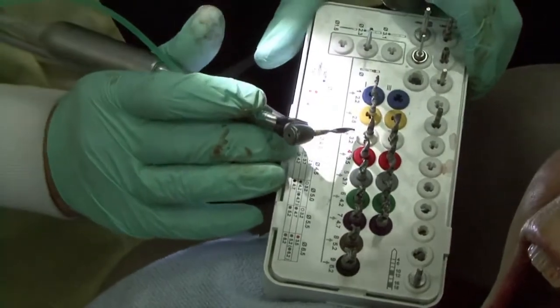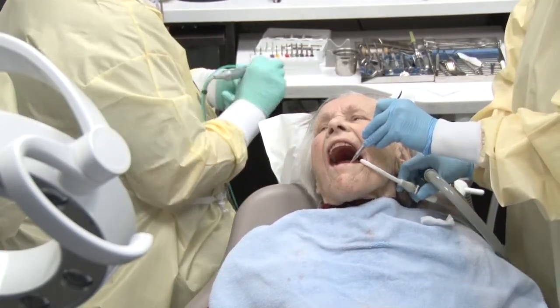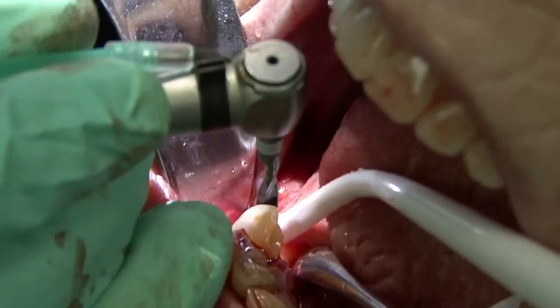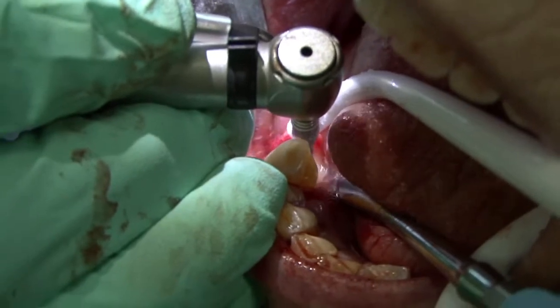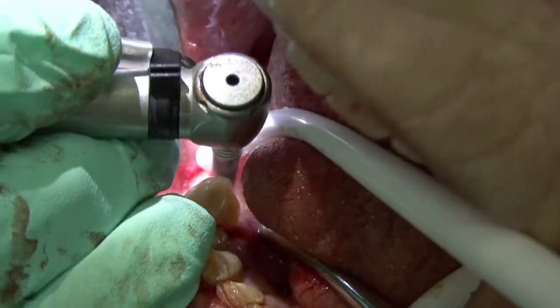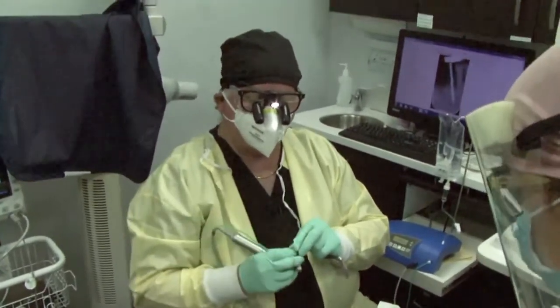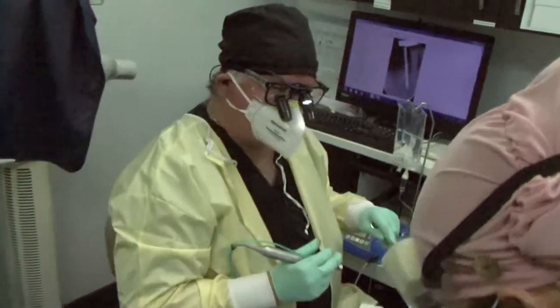We're going to go with the white drill, and we're going to take it a little bit more towards the lingual. And we'll then be using a 4.0 diameter. So when I put this in order to get it to go more to the lingual, I'm going to push in as I go down. And there we go. Okay, we're going to stop at 3.2 because we want to be able to ratchet to tighten. That's the difference between BLX and BLT, is that you want to be able to use your ratchet so that you can get primary retention.